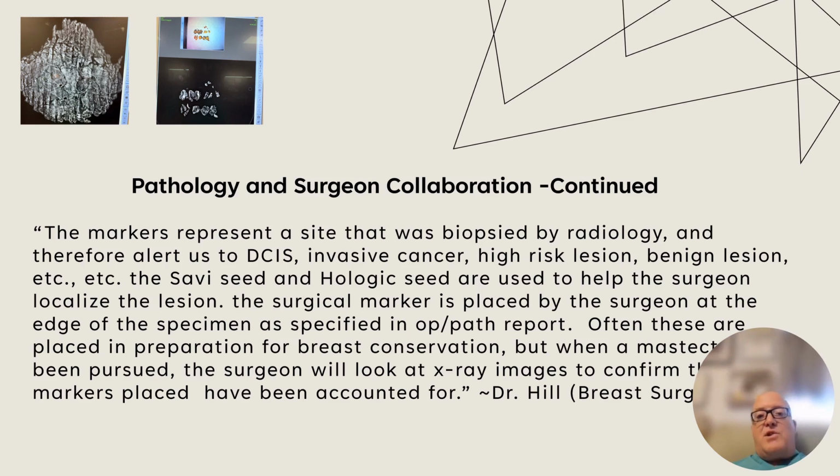Pathology and surgeon collaboration continue. These markers are placed in areas of abnormality, of lesion. If there's something that needs to come out, if it's pre-malignant or malignant, or it's going to be bothersome later on, they put in these markers when they biopsy these patients.